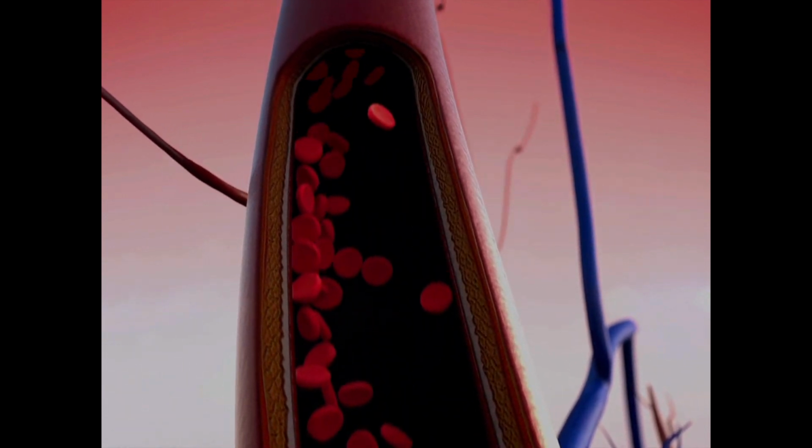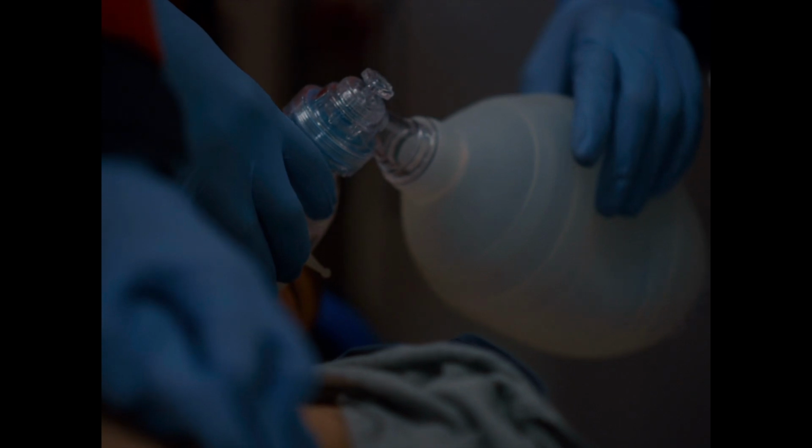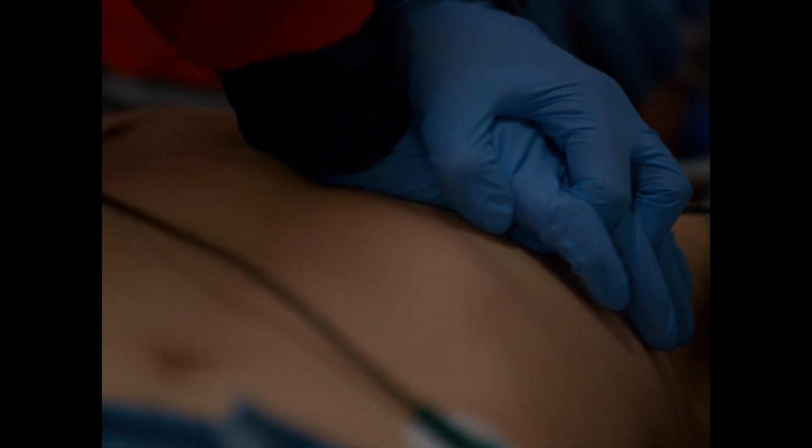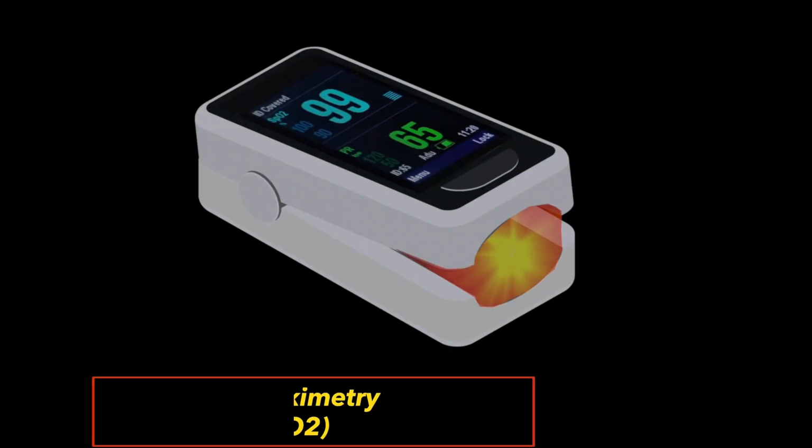Abnormalities in perfusion, such as those that may occur during CPR, can actually be detected through changes in EtCO2 levels. So you can actually look back on EtCO2 readings and see when the patient initially coded, when the CPR began, when the provider may have become fatigued and needed someone else to jump in, all the way until when ROSC first appears. Pulse oximetry, SpO2.